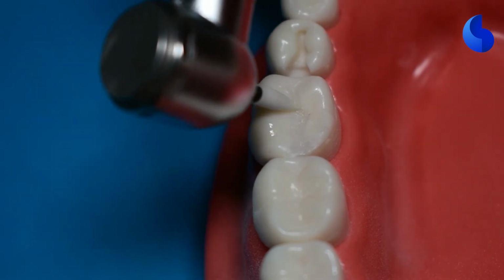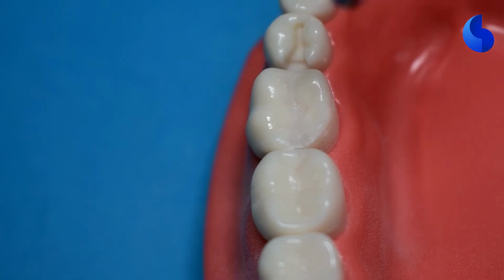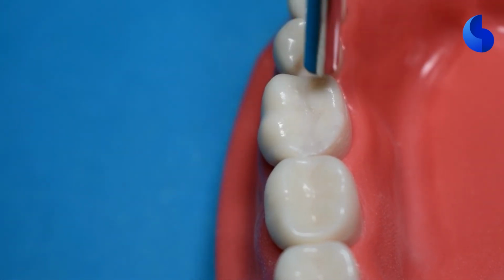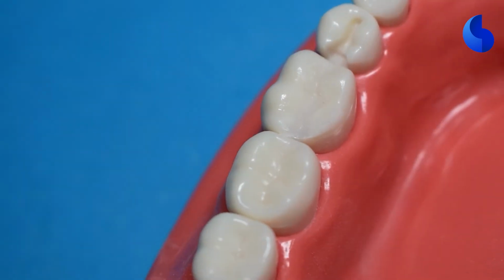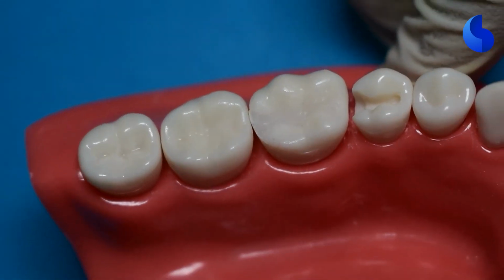At this point, we're almost done finishing our restoration. And you can take a look around your restoration to make sure that there's nothing sharp. At this point, we can see that the marginal ridge area is a little sharp, and it might be even a tad bit higher than the adjacent tooth.